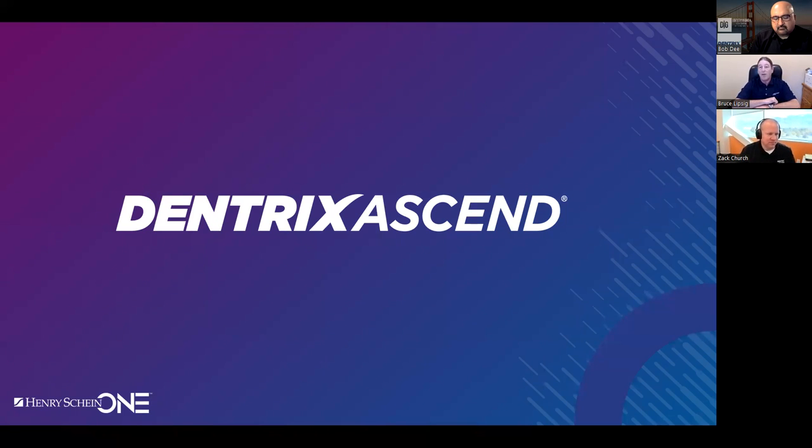Thank you, Zach, and good afternoon, Dr. Bob. My name is Bruce Lipsig, and I'm Vice President of Real Cloud Imaging. We are the exclusive imaging provider for Henry Schein One, and we create the Dentrix Ascend imaging product and the Dentrix Imaging Center, which works with the Dentrix on-prem G7 product as well. So we handle most of the imaging needs for Henry Schein One, and I'm excited to be here today and talk about our Dentrix Ascend product and our Dentrix Ascend imaging. Thank you very much for having us, Bob.